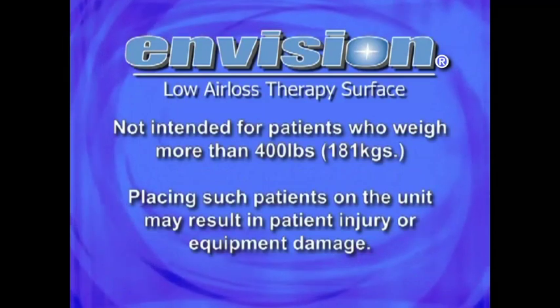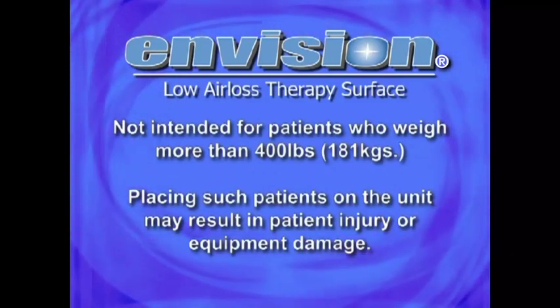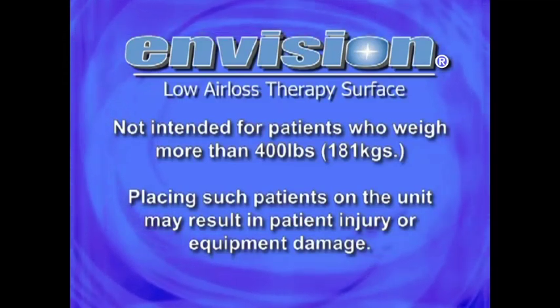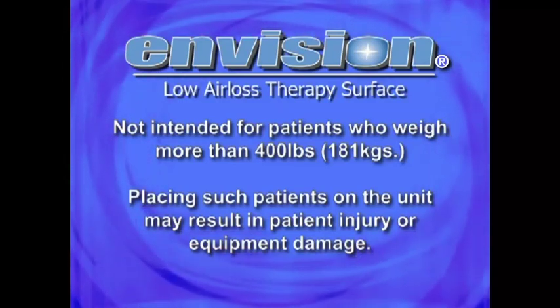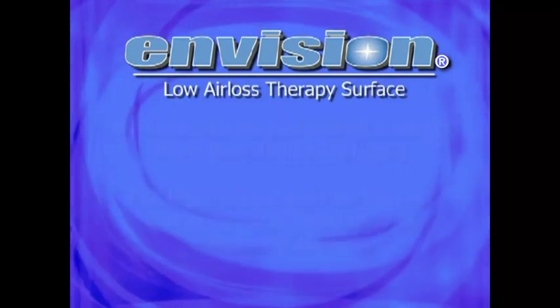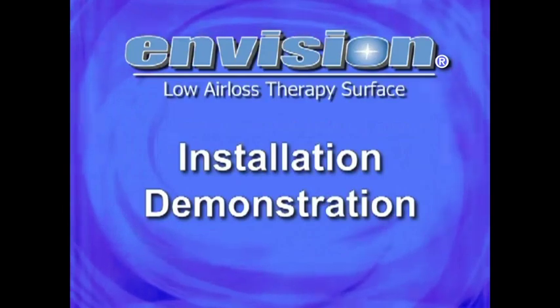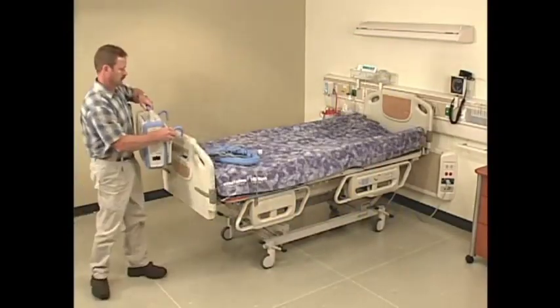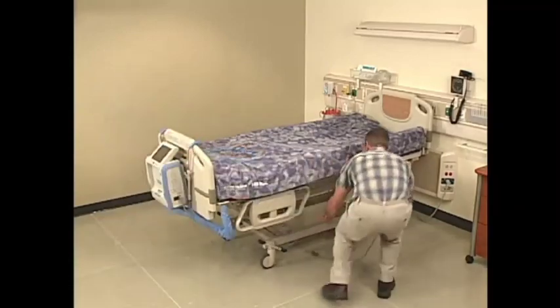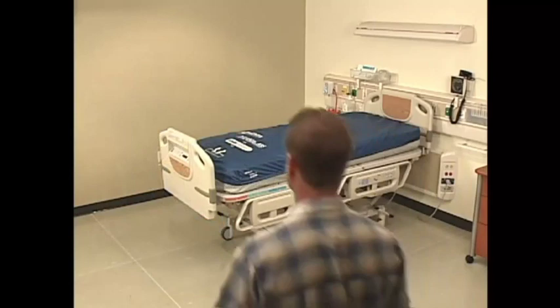The ENVISION surface is not intended for patients who weigh more than 400 pounds, or 181 kilograms. Placing such patients on the unit may result in patient injury or equipment damage. In this installation demonstration, we'll show the procedure a service technician uses for placing the surface on an Advanta frame. The steps service performs for other bed frames will be similar to this procedure.